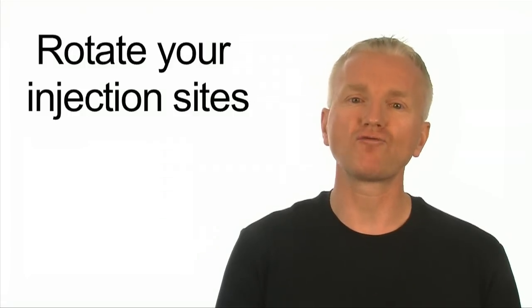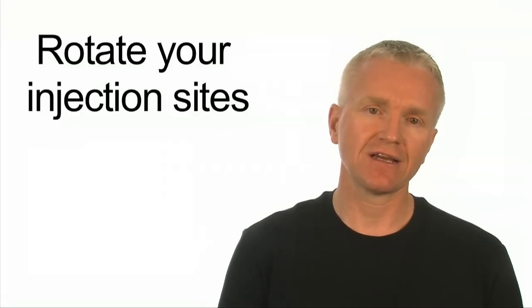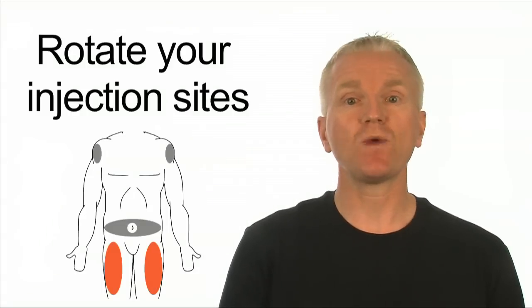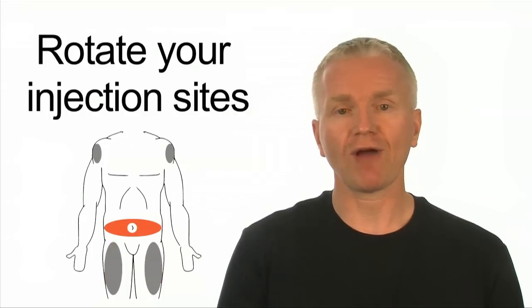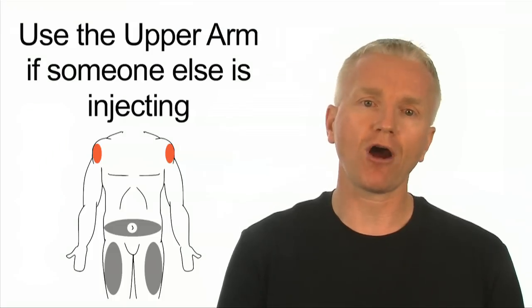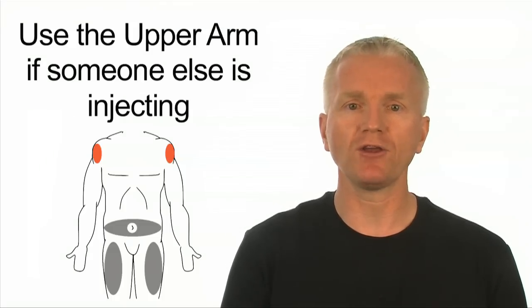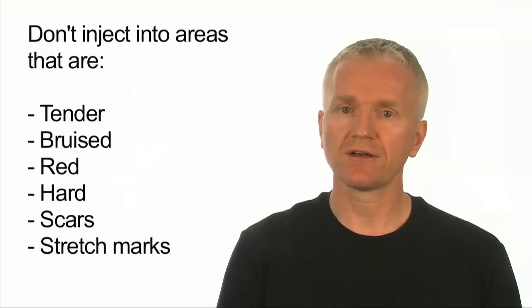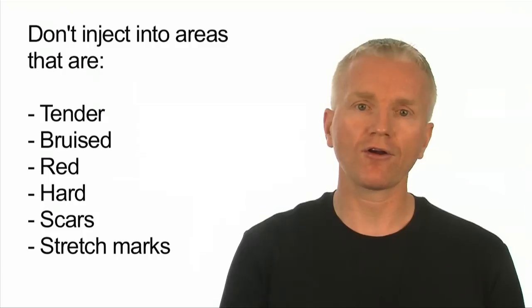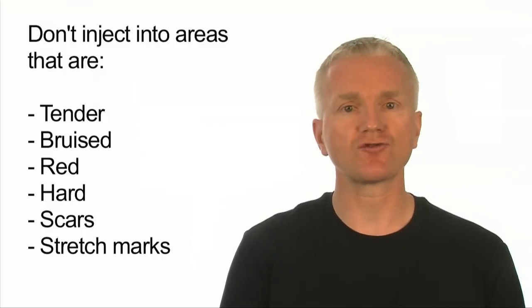It's a good idea to rotate your injection sites. For example, this week you might place the injection into your thigh, and next week into your abdomen. You can also use the upper arms if someone else is helping you with the injection. If you're injecting into your abdomen, stay away from the two inches around your belly button. Don't inject into an area that is tender, bruised, red, hard, or one that has scars or stretch marks.